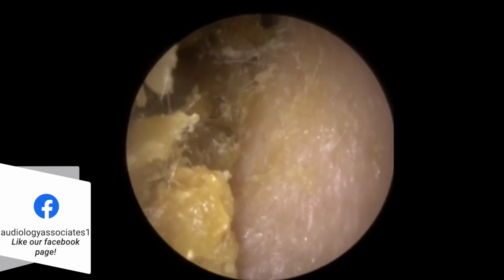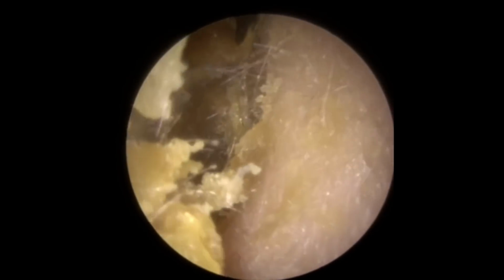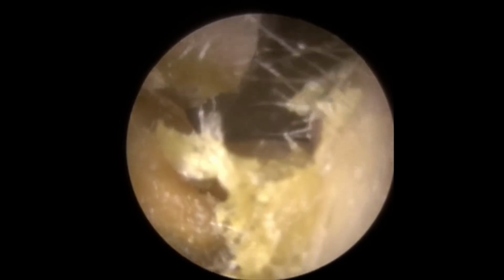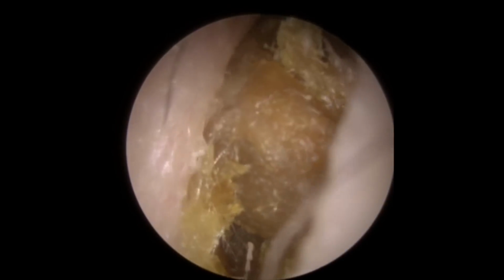Really stuck to that right canal wall, so just working down the right side now, just freeing that up a little bit. Also just starting, you can see the front end there is not detaching from the main bulk of wax, it's all staying really firmly attached together. So just there. Now there's a gap starting to appear top right corner. There I can see it now a little bit more. You can get behind it now, so we've managed to work behind that sticky piece of wax, working its way out of the canal. There we go, it's starting to move.